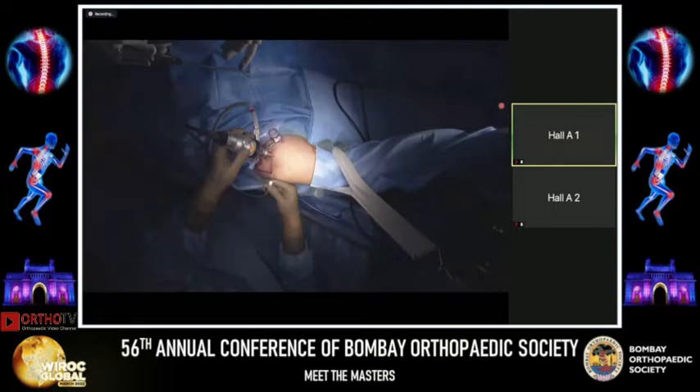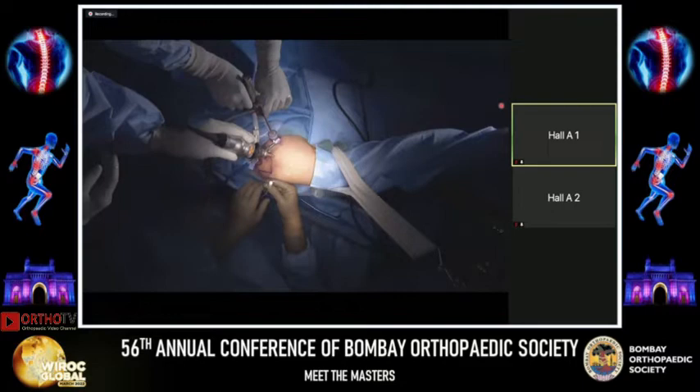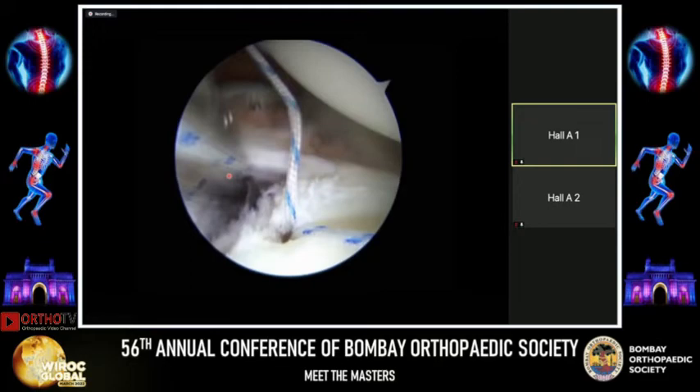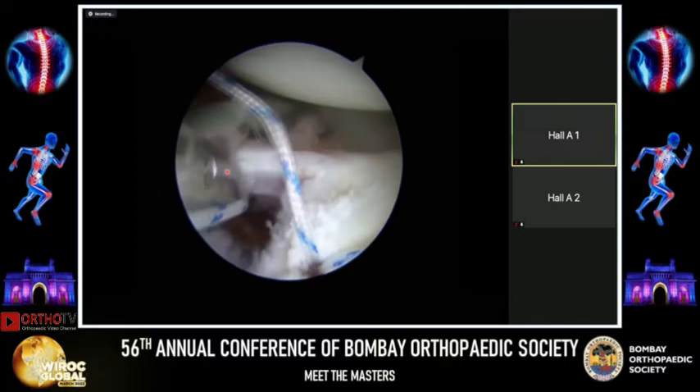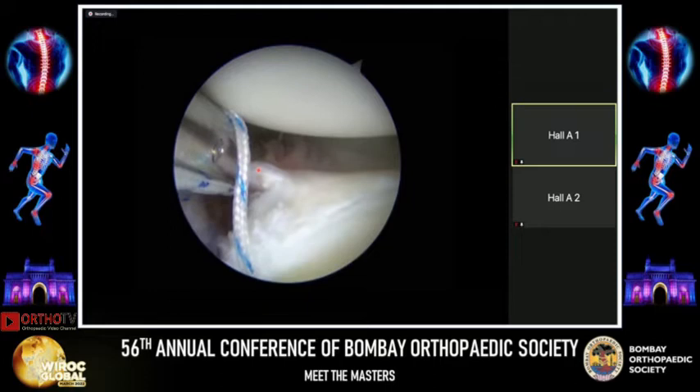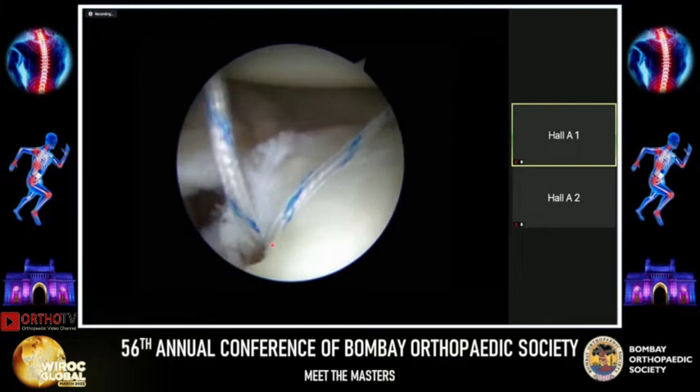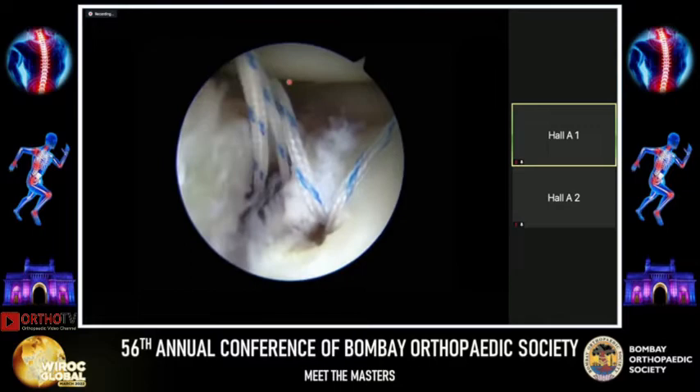I use a suture retriever to take one limb through the posterior portal and pass the second limb into a suture passer. Through the anterior portal, this suture passer takes a bite of the anterior inferior labrum and capsule. When doing this, you slide the mouth of the instrument on both sides of the capsule, ensuring the inferior jaw doesn't capture more than the capsule — a bite of about 12 to 13 millimeters — to achieve a capsular shift.